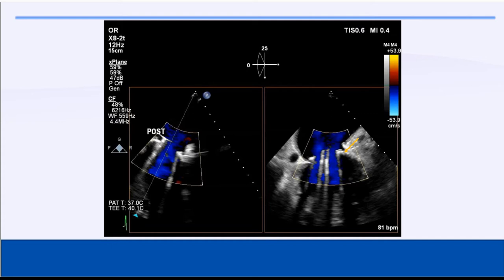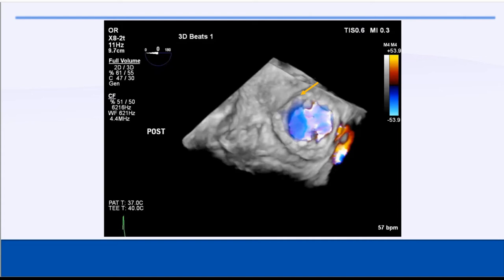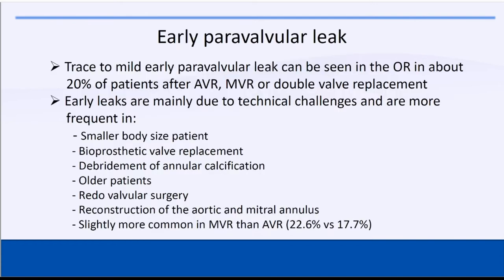This question came up that day as well — should we leave it, or should we tell the surgeon to do something? We showed it in 3D as well, and here you can see a very small paravalvular leak between the mitral valve and the aorta, in the anterior aspect of the mitral valve. Early paravalvular leak is very common after valve replacement, about 20% of the time — trace to mild leak.